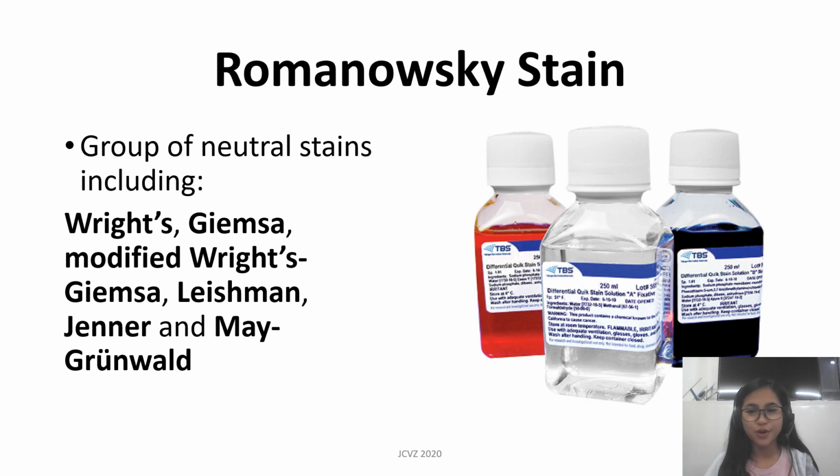Next, we have our Romanovsky stain. Romanovsky stains are widely used, especially for microscopic examinations of blood or bone marrow films. Some of the group of neutral stains under Romanovsky stain include your Wright's and your Giemsa.